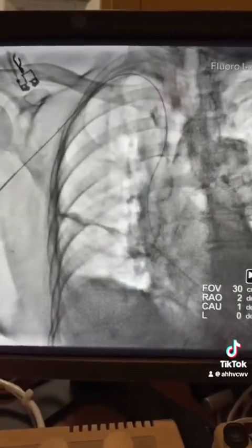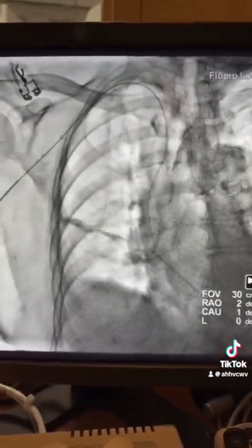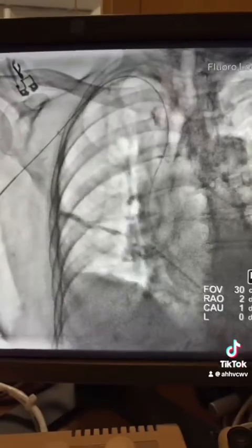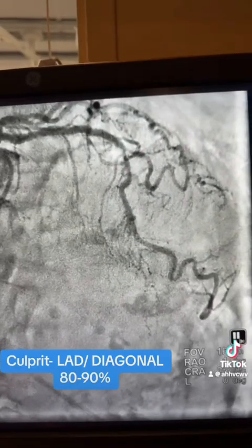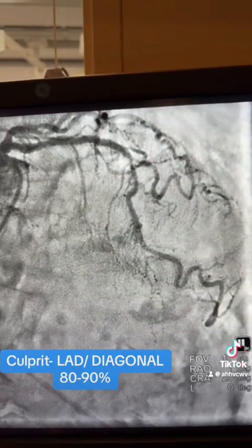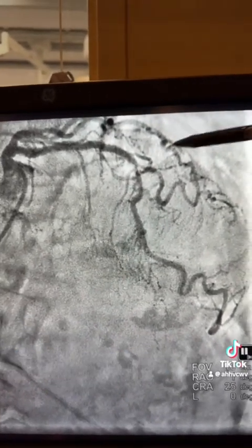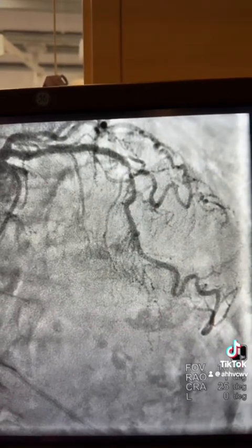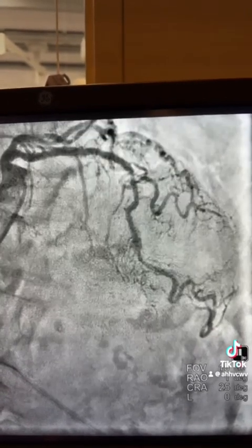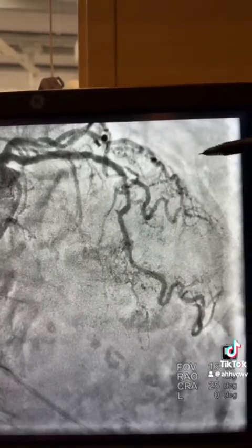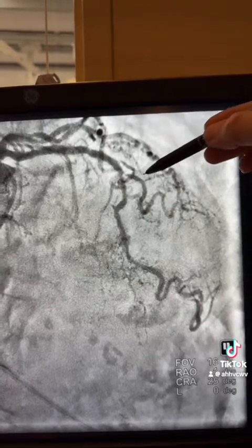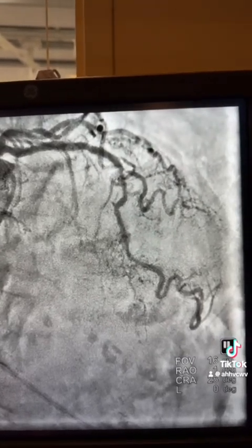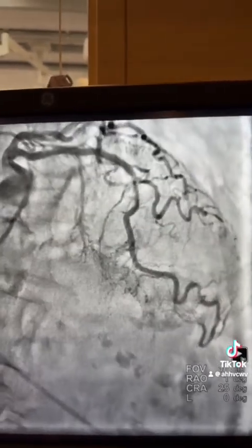Finally in the aortic root and then taking pictures — the culprit lesion was this mid-LAD and large diagonal, kind of 80-90% calcified lesion, more than 90% in the diagonal and less in the LAD, but heavily calcified.